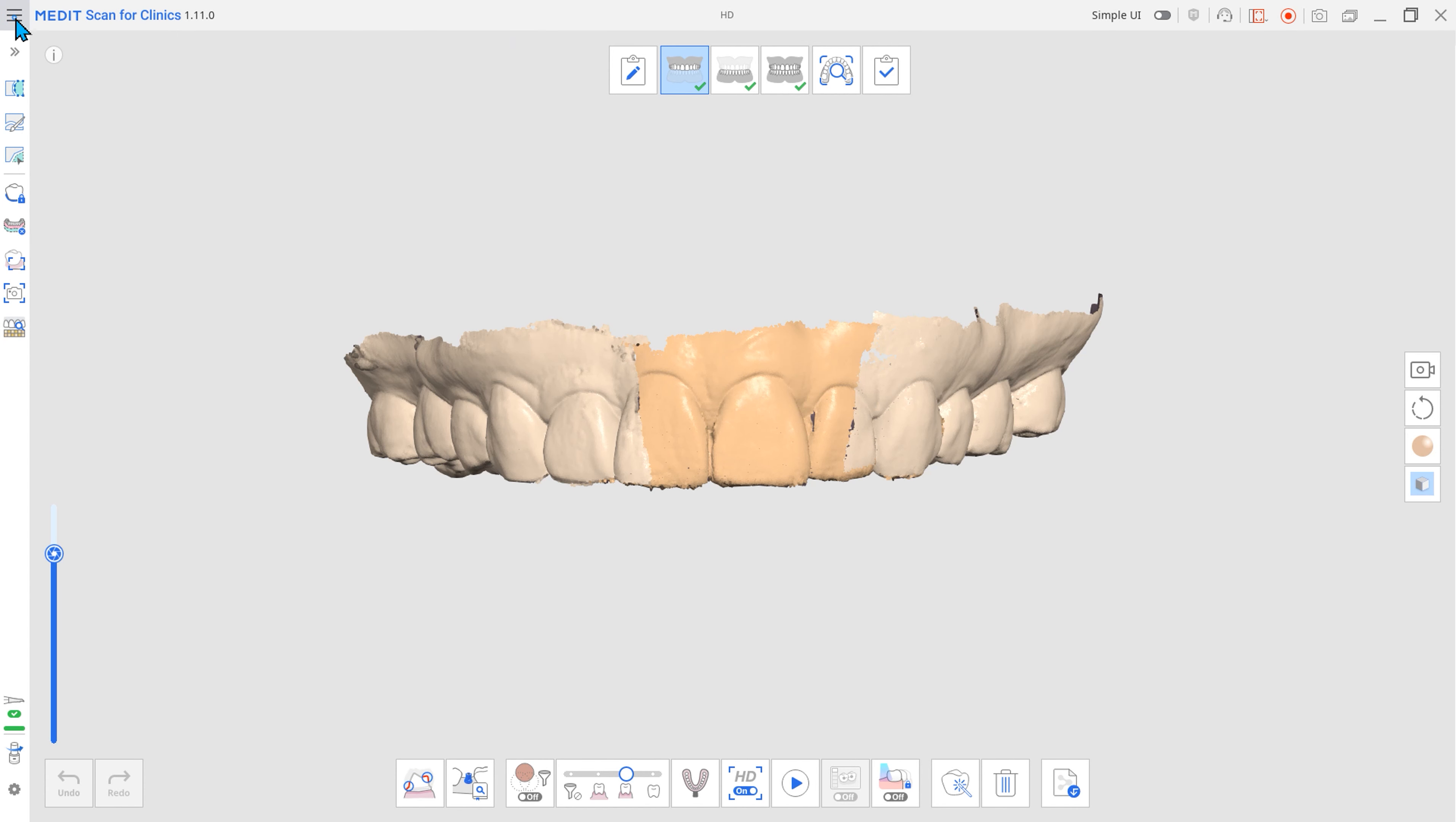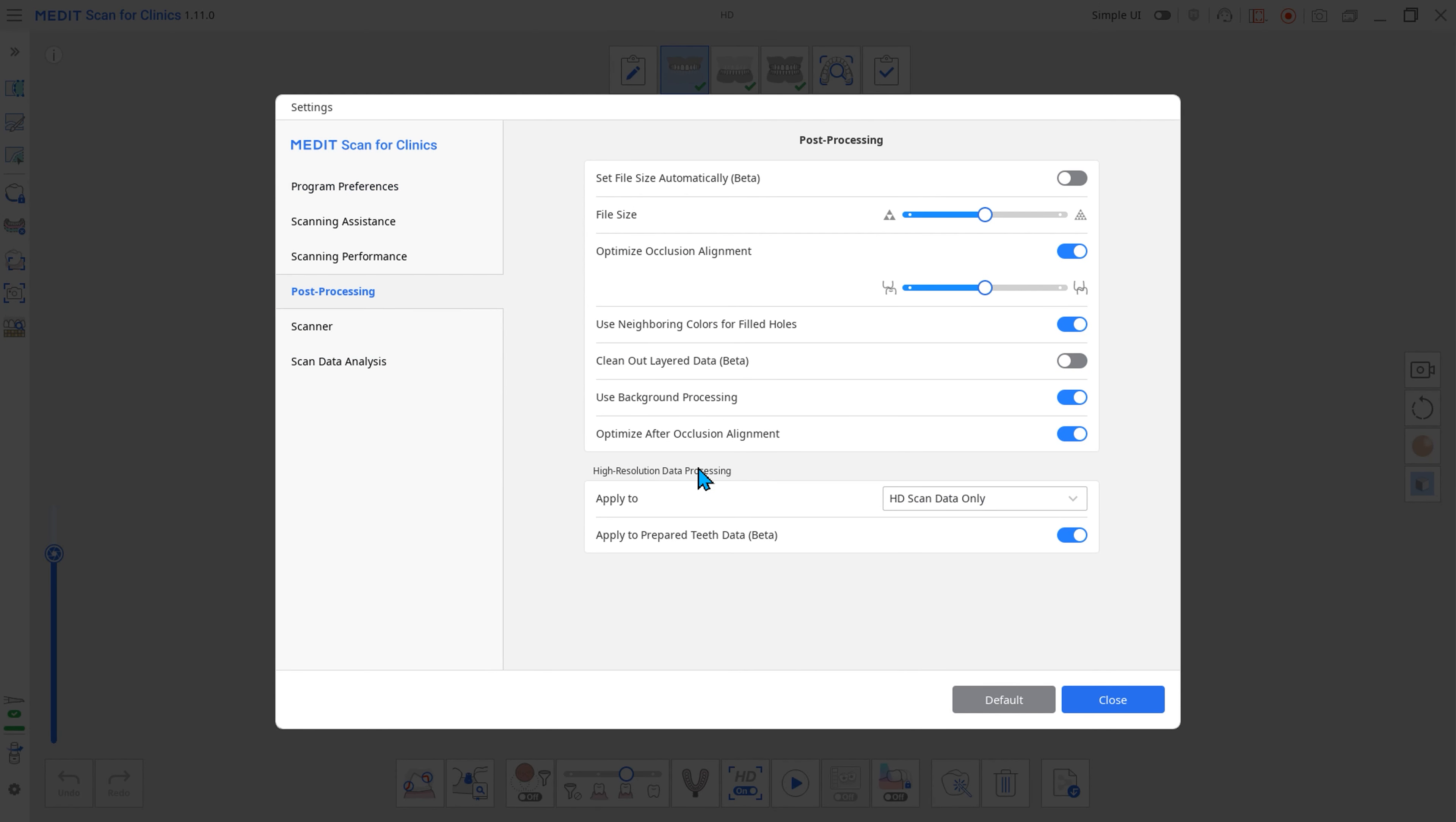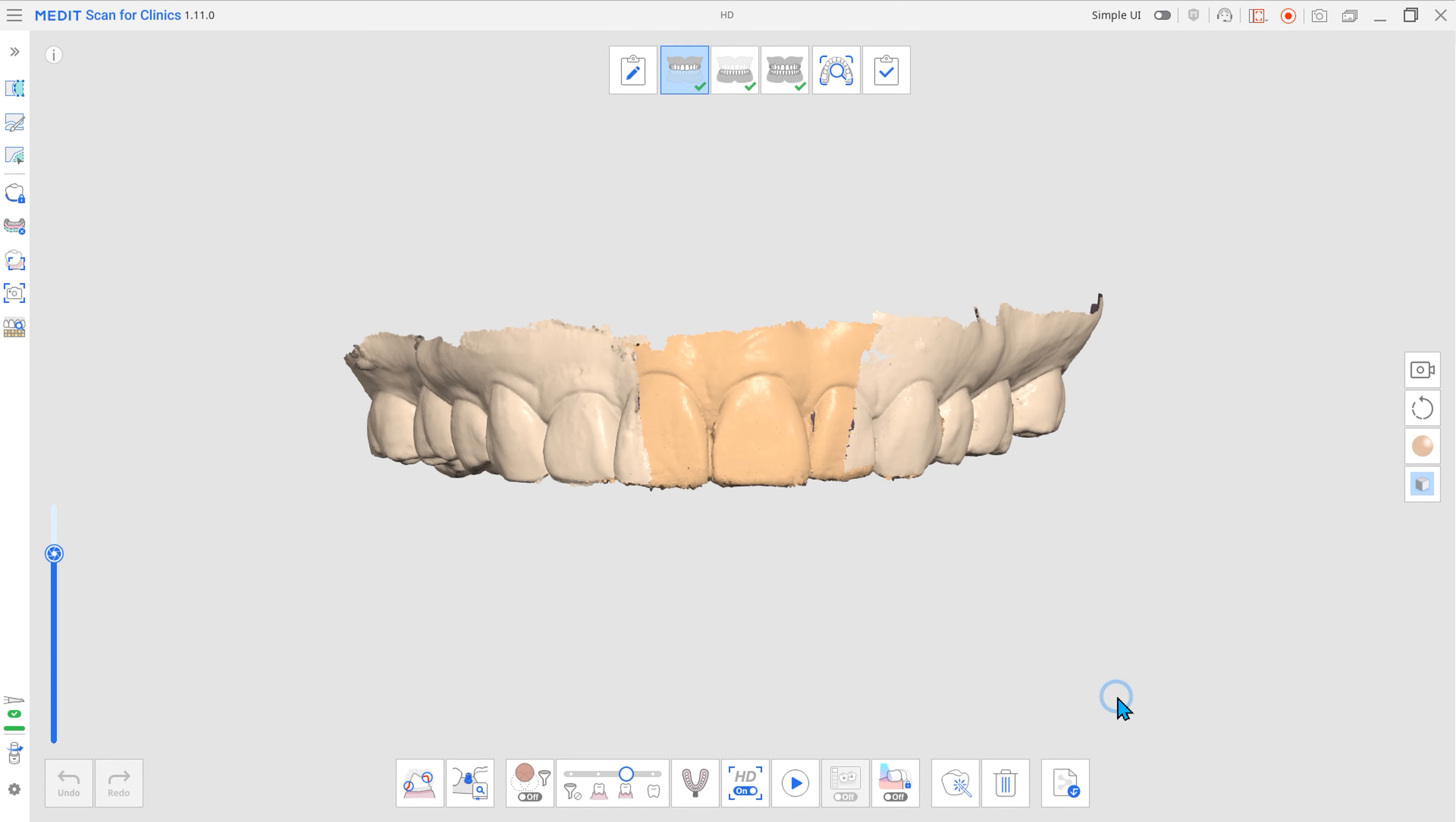Let's start with the new features. High-resolution data processing uses Medit's AI technology to automatically detect prepared teeth for crowns and produces high-resolution data in the area. You can get high-resolution data without any additional manipulation and get sharper data than the previous version.